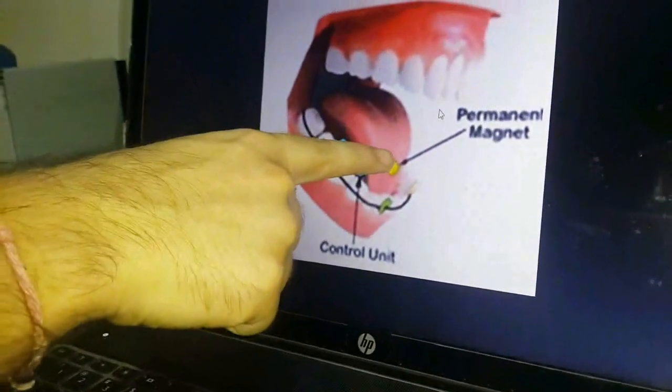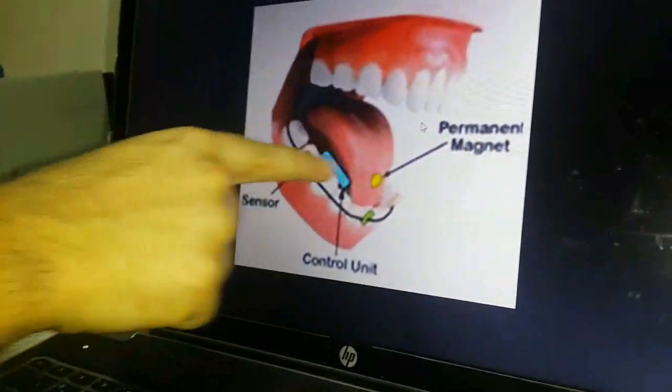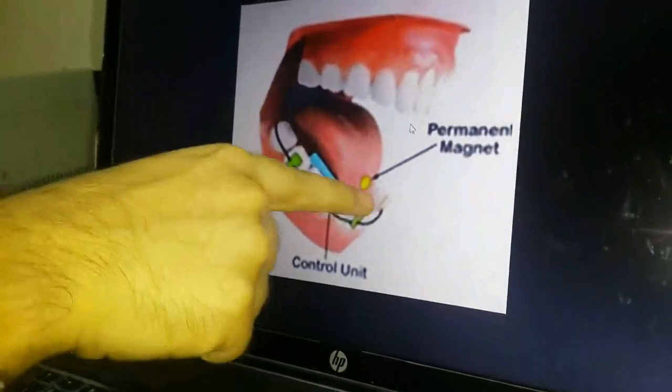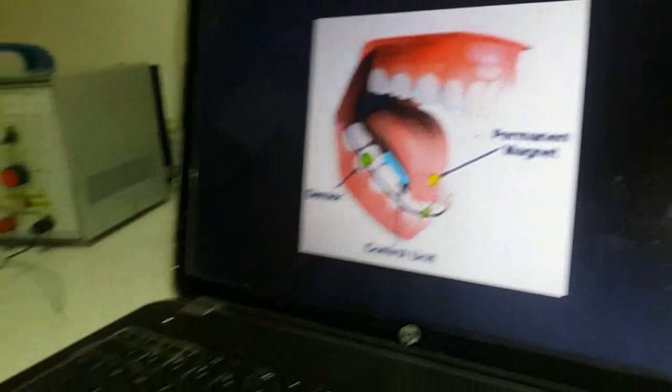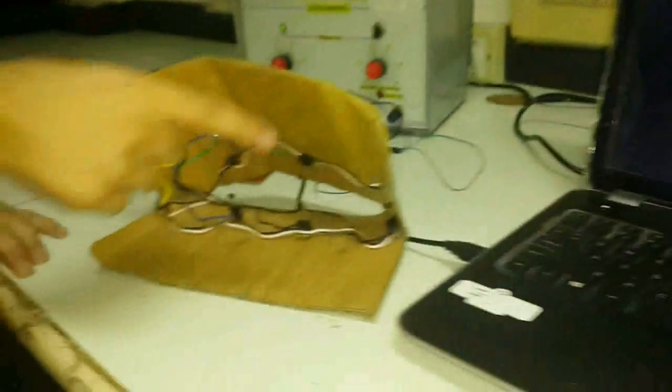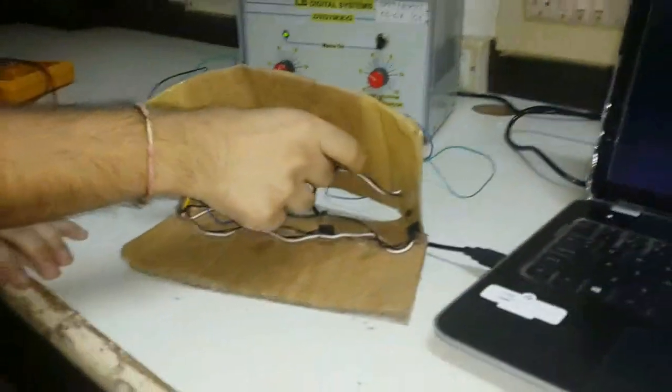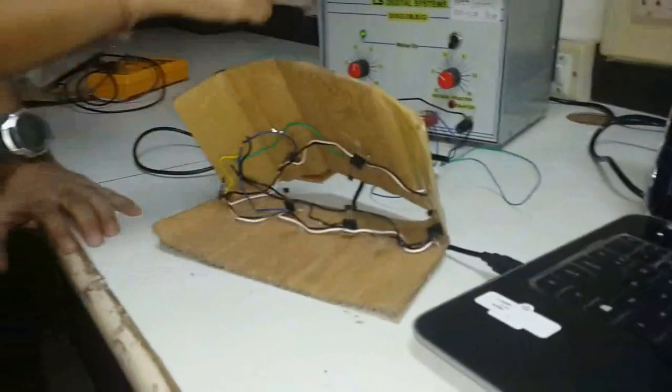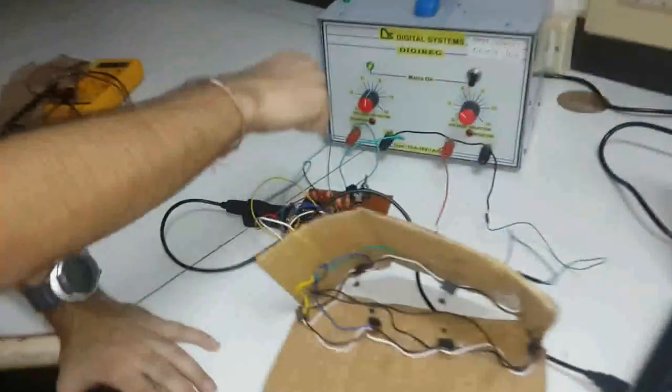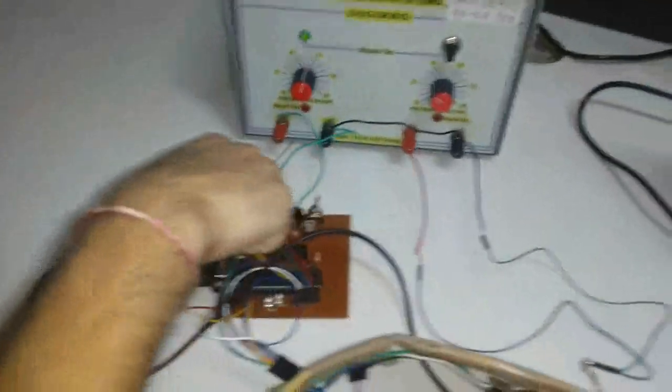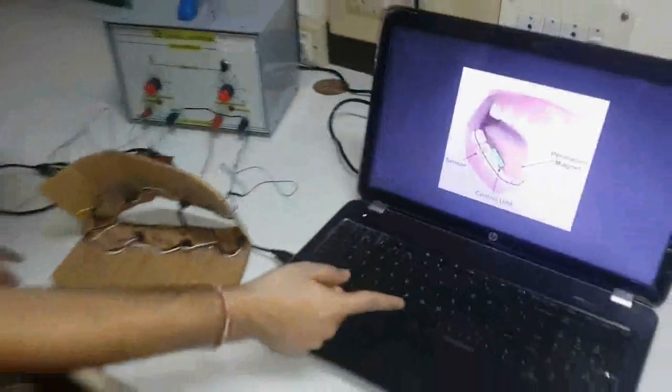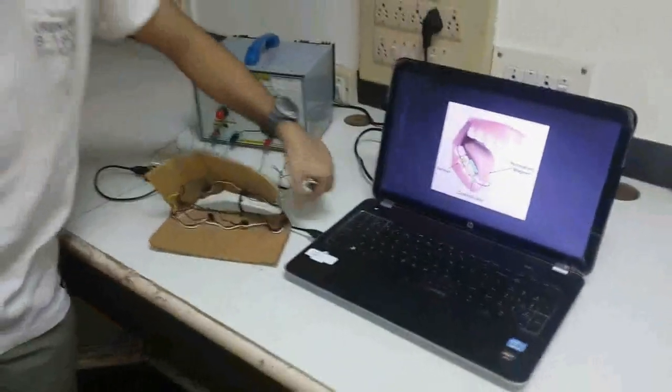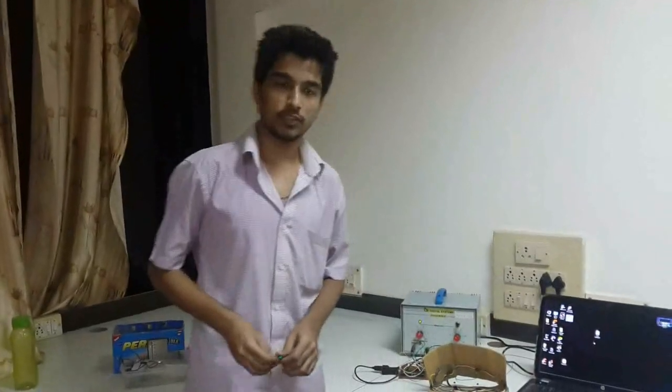The magnetic sensors give their specific commands to this main circuitry which processes them, converts them to signals, and sends them to the computer via this serial port. Let's see the demonstration of this project.